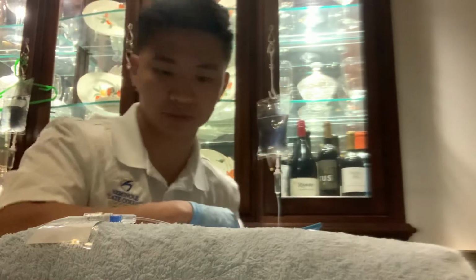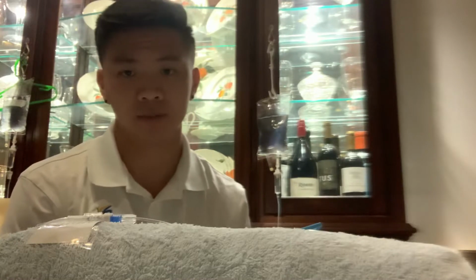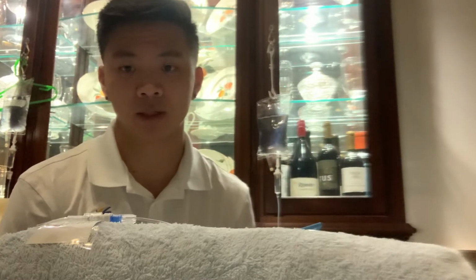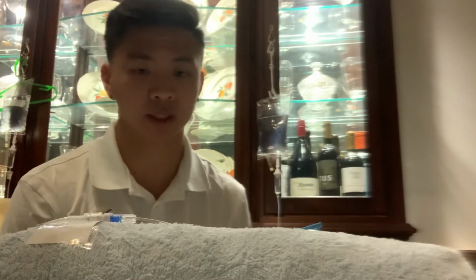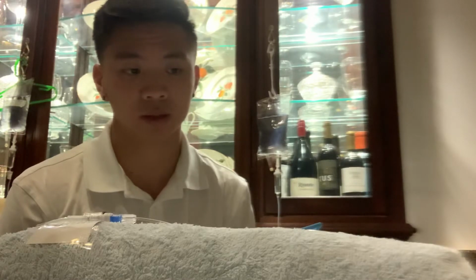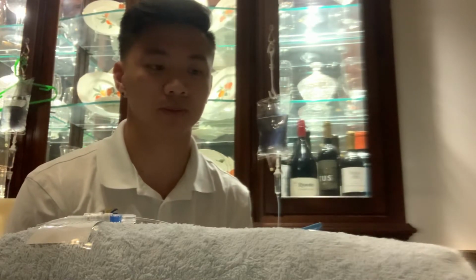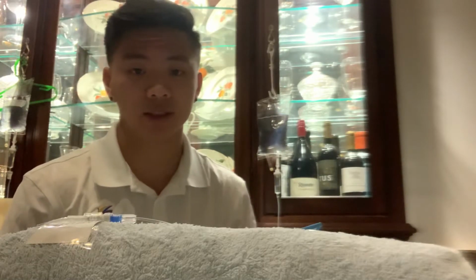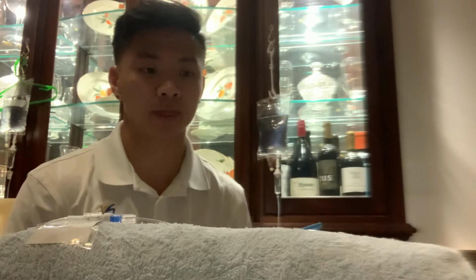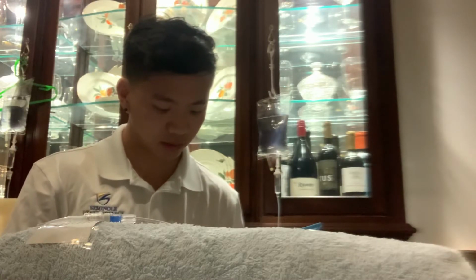And then after that, I'm gonna go ahead and monitor the patient, make sure that the infusion rate is proper, correct. I'm gonna go ahead and test the IV site for any infiltration or phlebitis, which there isn't. And then I'm gonna go ahead and document the assessment findings.